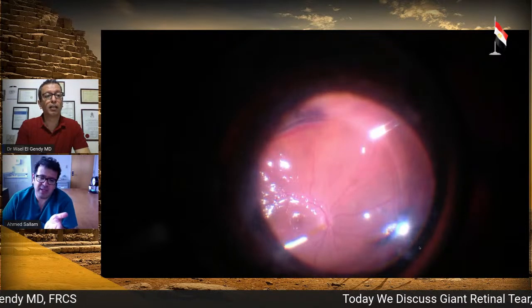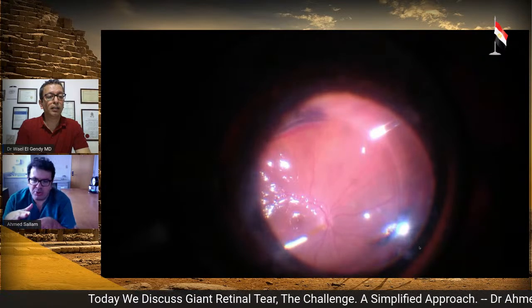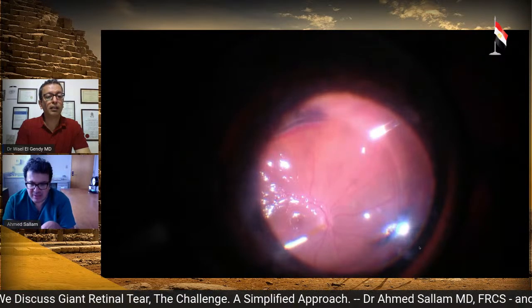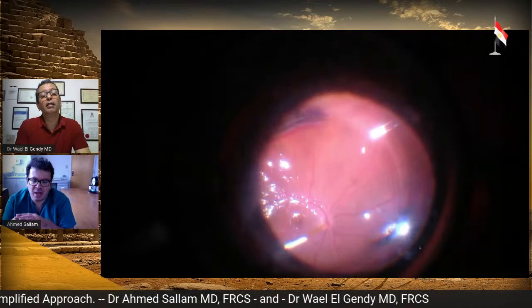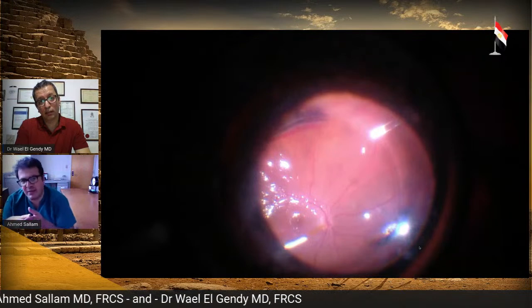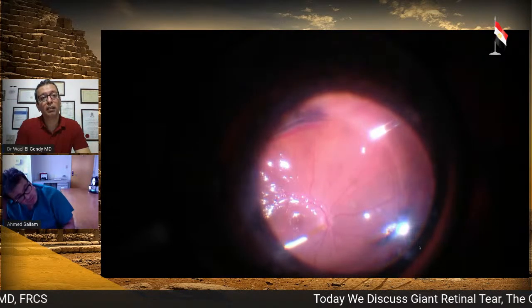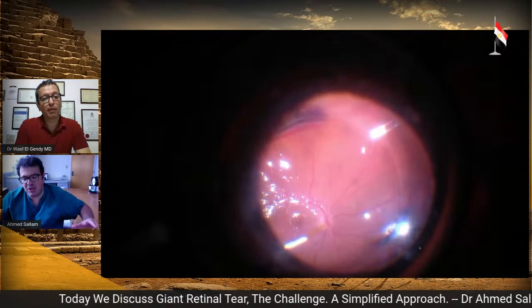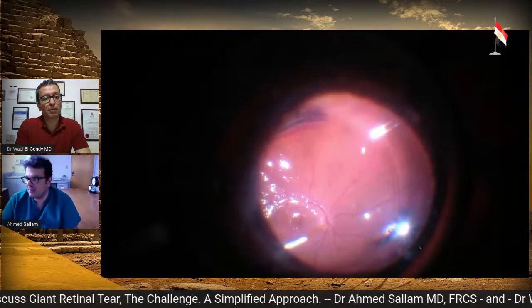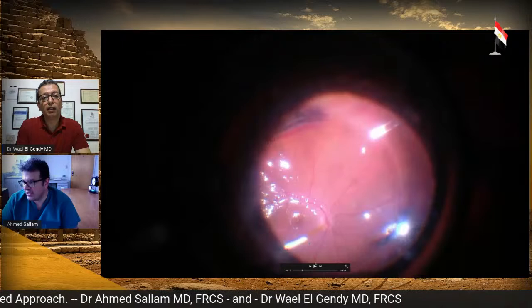And the important thing as well, which is usually not the case in giant retinal tear, but maybe if there's PVR, you want to try to relieve the PVR at least initially and put the perfluorine, because if you shoot over PVR, it may then just go under the retina. So make sure you really relax the posterior retina if there's PVR, put the PFCL, and then continue to relax and add more PFCL. Okay, so this is the case here, so filled up.